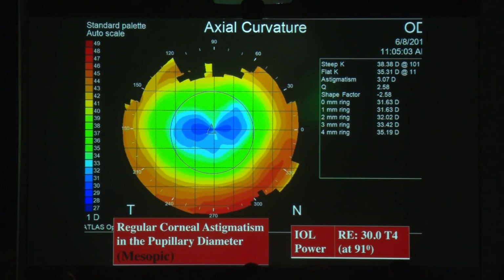Now, to our surprise, and thanks to the RK surgeon who spared the central cornea, the central cornea, if you see on the topography, has a very regular astigmatism. Now, what we need to see, most devices, all topographers, Pentacams, aberrometers, they will give you the patient's pupil size during the scan capture, which is this black circle. And also what we do as a practice, at least for those of you who don't have the highest-end SS-OCT, the swept source OCT, the newer machines say that they are going to be independent of the illumination.